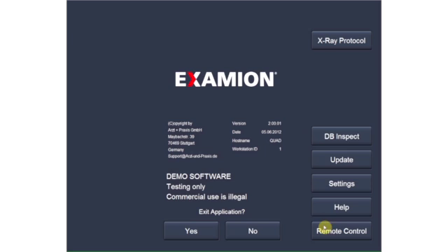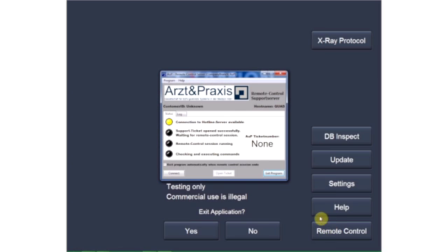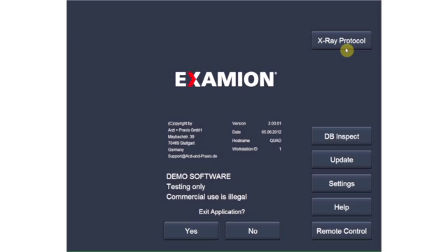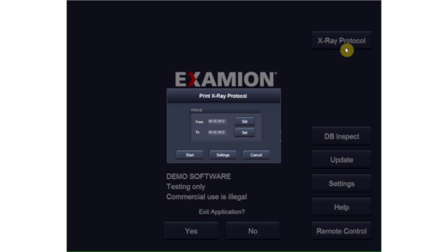The remote control button connects you to remote support, giving our support team quick access to your computer in the event of any difficulties. Use the X-ray protocol button to make entries in the protocol. You can also print out the X-ray protocol for a defined time period.